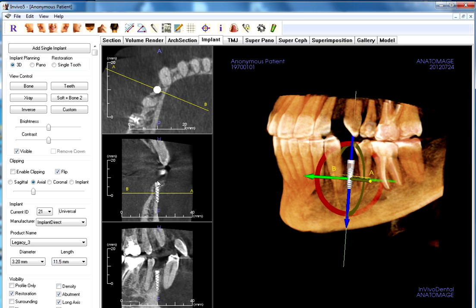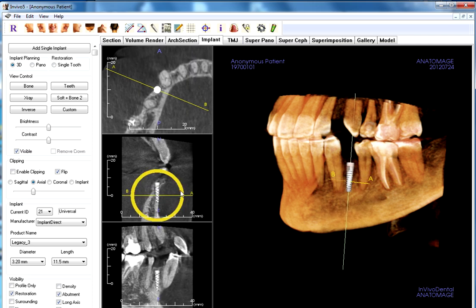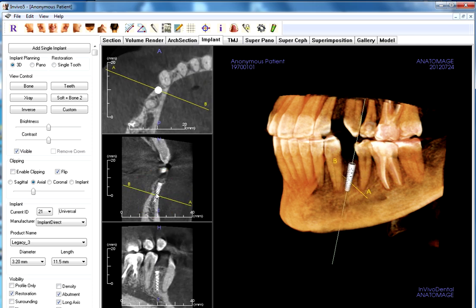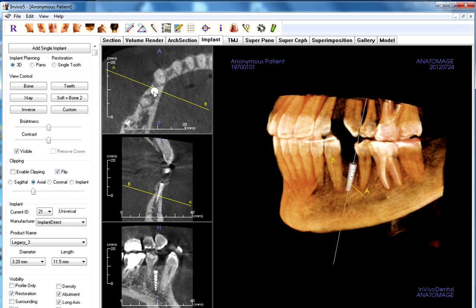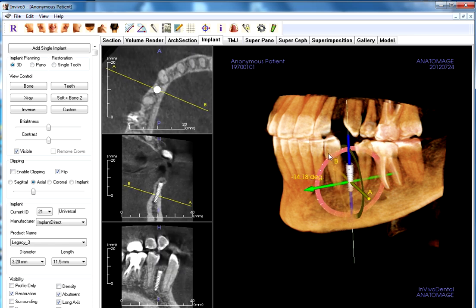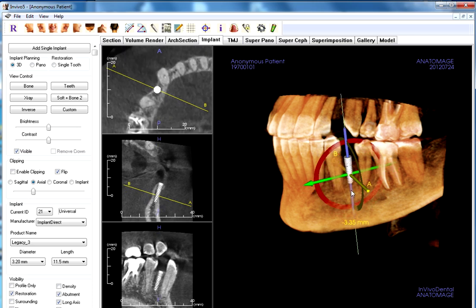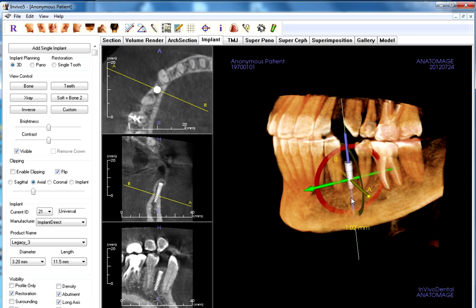I'll be using these different frames to place this implant right where I think it's the most optimal place for the bone that we have to work with. You can see I can move the implant mesially, distally, tilted buccal, lingual. Use these tools over here to get the right angle and pitch. I can increase or decrease the height.